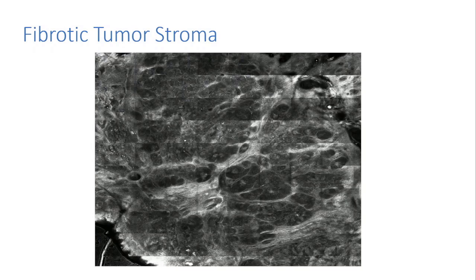So tumor microenvironments are becoming really hot area of research for all different types of cancers. And we're using confocal now to explore the tumor microenvironment, not just the stroma, not just the dense collagen network like in basal cell carcinoma, but even things like melanoma. We can see cells that are being recruited early, and using real-time optics, you could see inflammatory infiltrates that are surrounding the tumor and comprising the tumor microenvironment. So that's becoming a real big area of research.